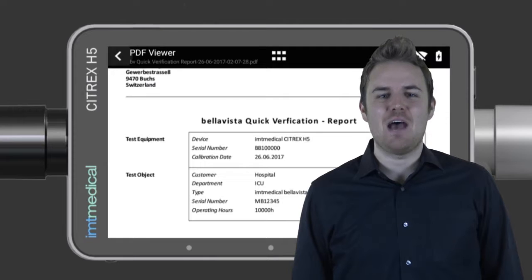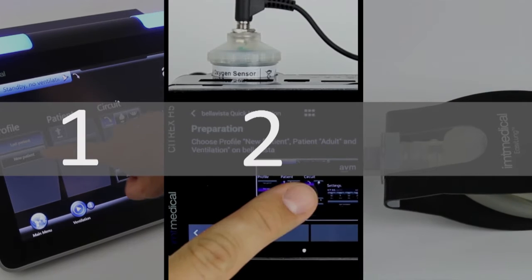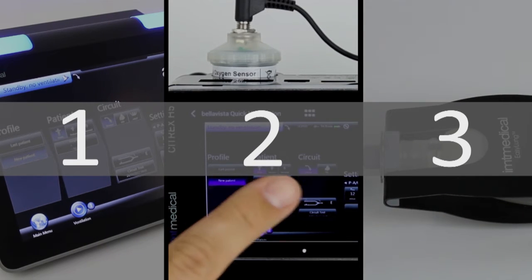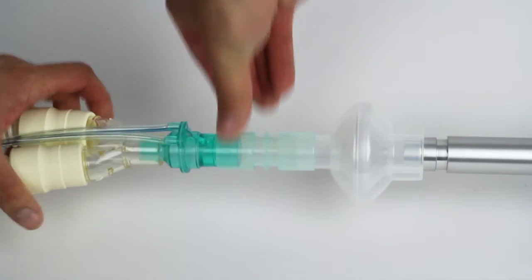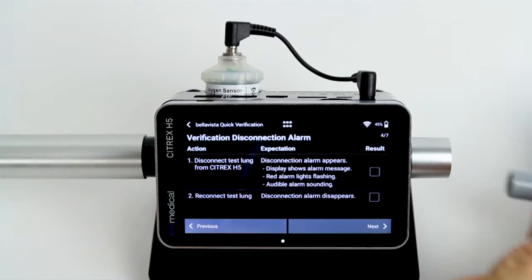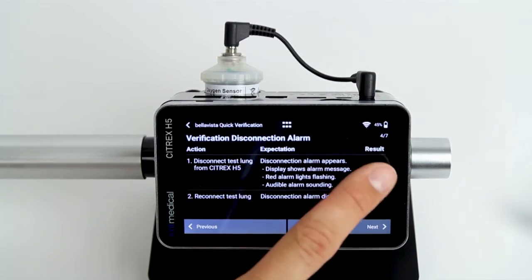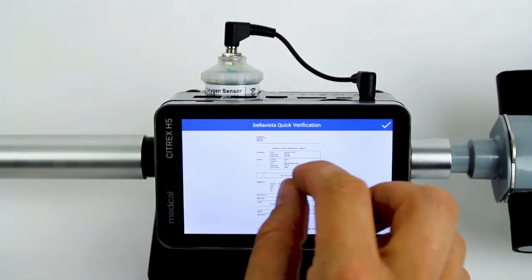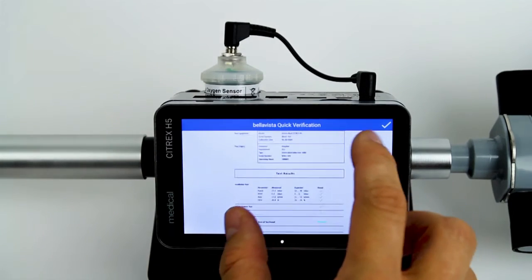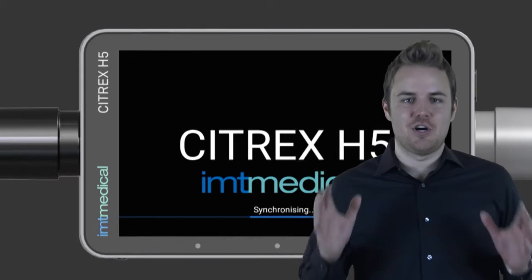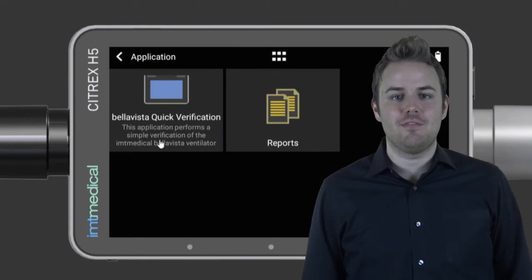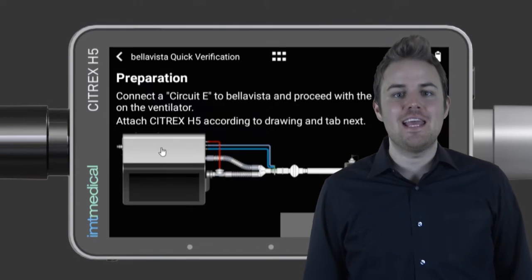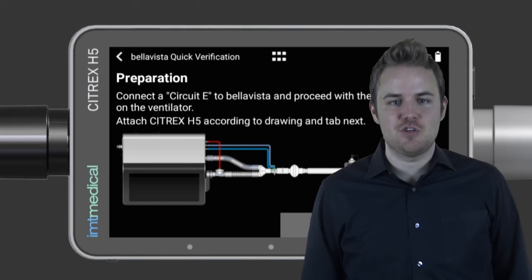The app guides you through three simple steps. First, connect the Citrix H5 to a ventilator. Second, perform verification. And finally, generate a test report. So let's get started — launch the app: Bella Vista Quick Verification on the Citrix H5.